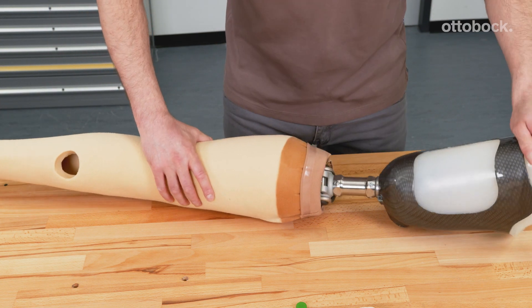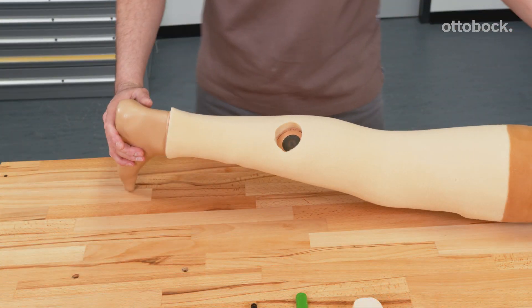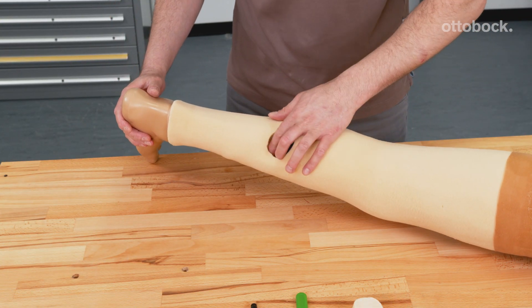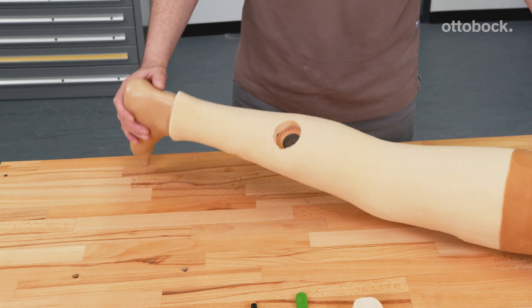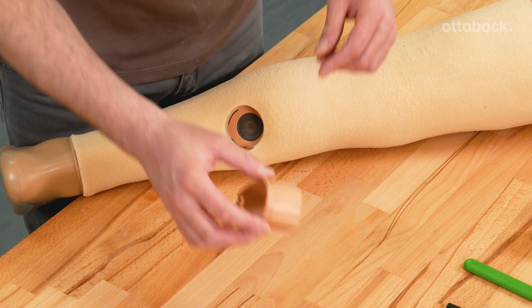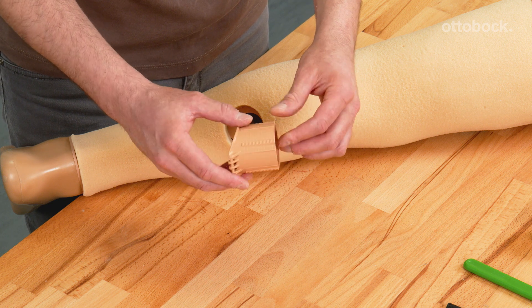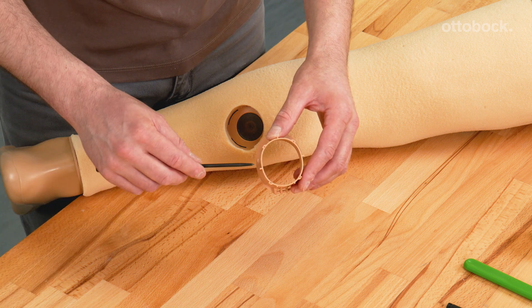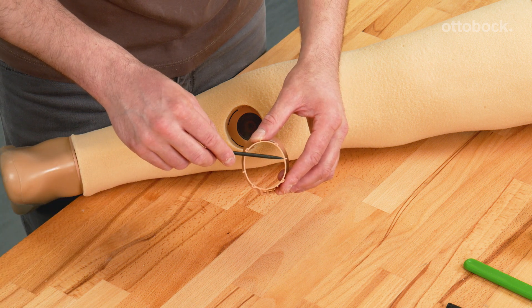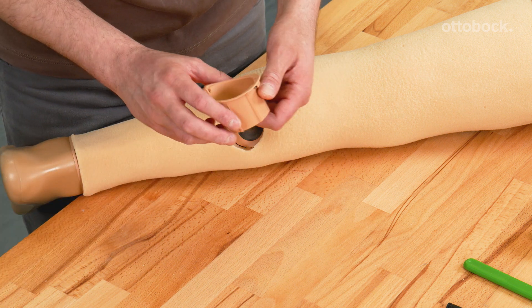Re-apply the foam cover and connect the foot. Position the cut hole over the charging shaft receiver. Please note the correct orientation of the charging shaft when installing it. The hinge must be positioned in distal direction. The two offset projected lugs on the charging shaft must be placed medio-lateral into the charging shaft receiver.